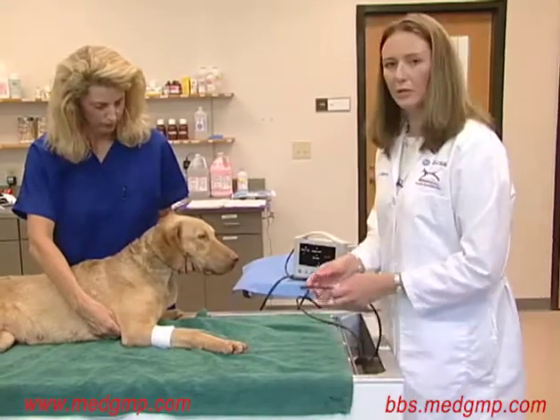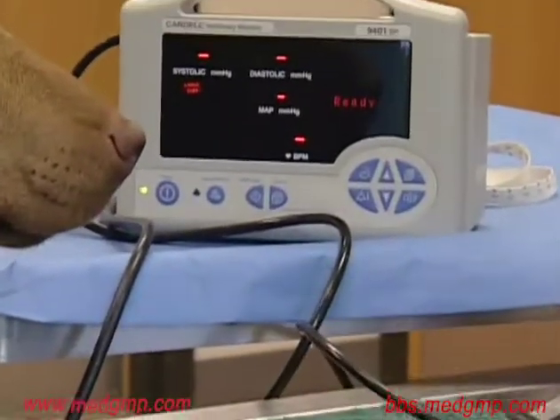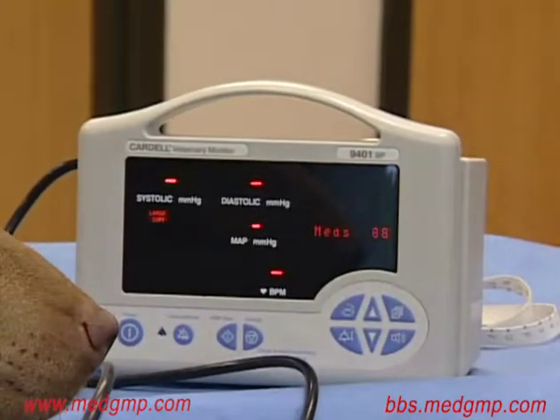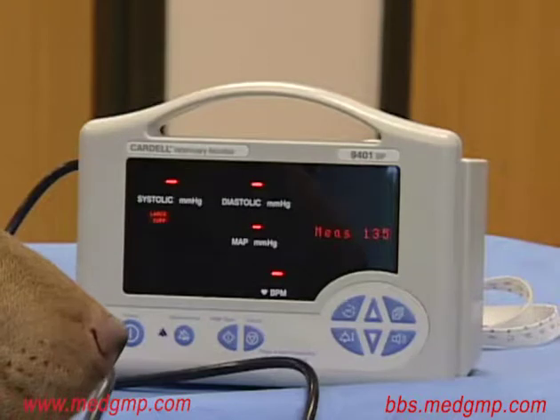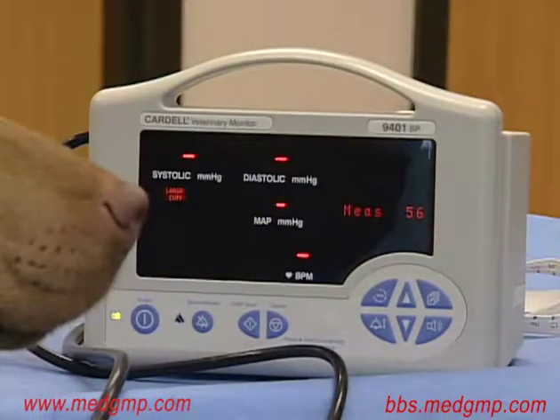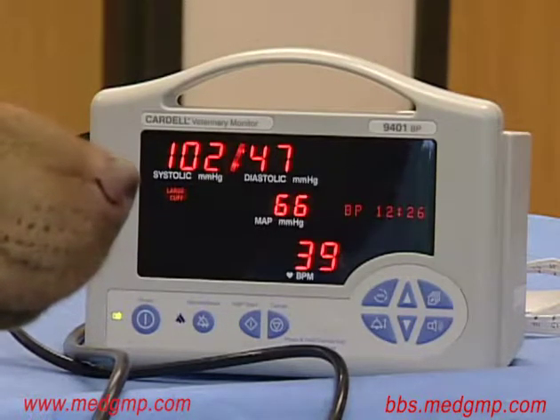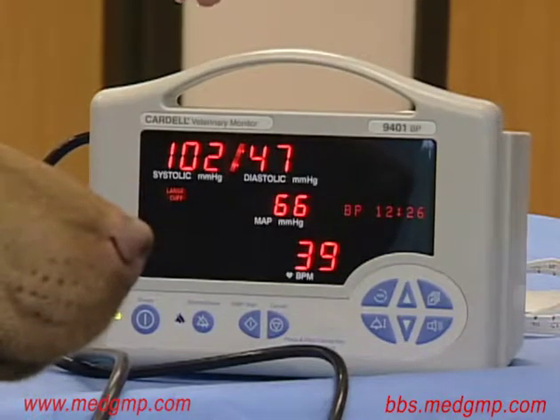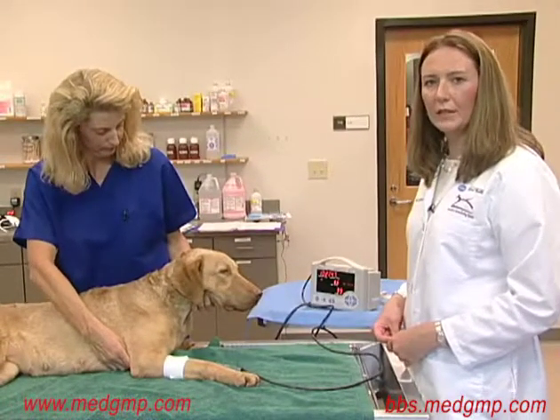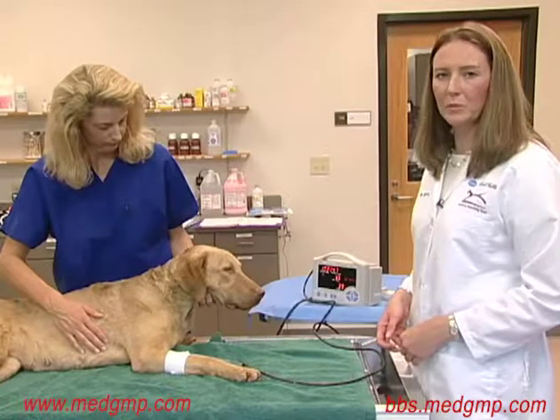We then connect to the oscillometric machine and initiate the readings. It does take a period of time for the oscillometric machine to obtain its readings, but it manages to obtain systolic, diastolic, and mean blood pressures. We've been able to record results showing the systolic, diastolic, and mean arterial pressure. As with the Doppler method, it's important to take a number of readings and average those, and again record all measurements along with the cuff size and location in the medical record.